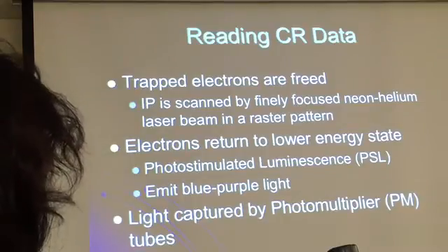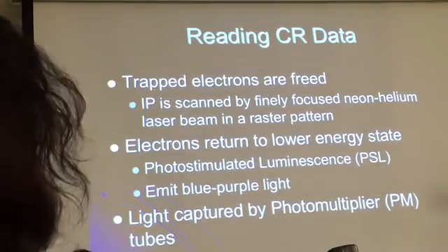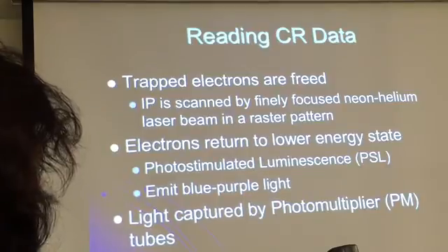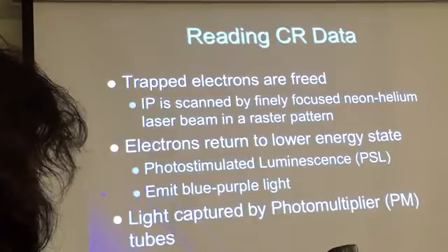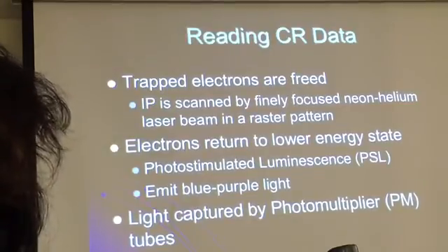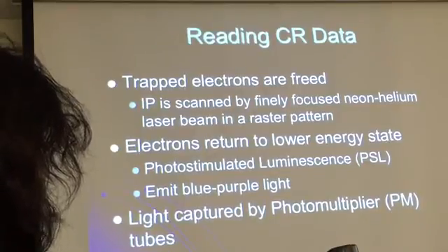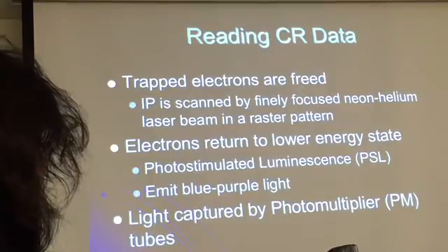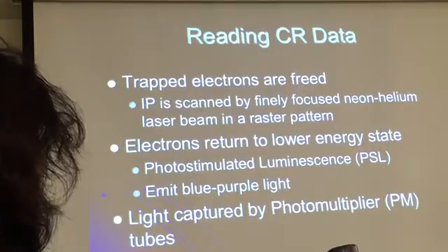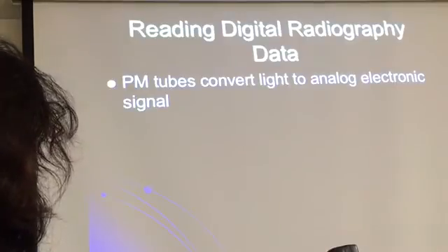Everybody okay? Good. So the photomultiplier will capture this light. It's like a sack capturing all this light. All the light photons are put in here, and through a process, on the other side of the sack, you end up with electrons. So you start with light photons, and then you create electrons. So this slide is the last one, so hang in here.